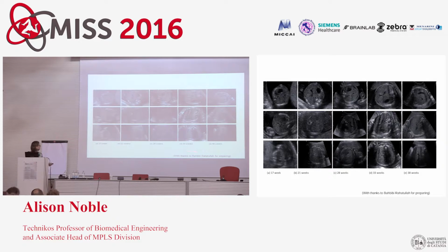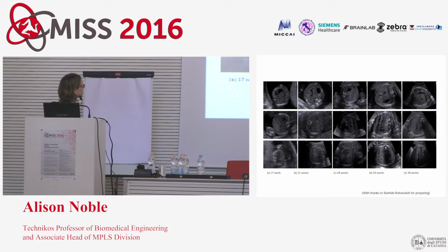this is shown for ultrasound data again, looking at fetal scans going from 17 weeks to 38 weeks of gestational age. So in other words, the fetus has grown over this time. What's shown on the top is what we would call good quality data. This is of a fetal abdomen. You can make out there are structures here. The blob-like structure is the abdomen. You have information here about the ribs and particularly the umbilical vein.